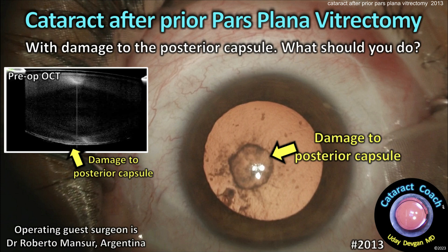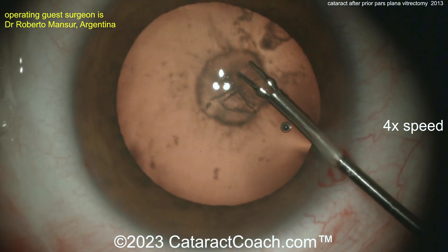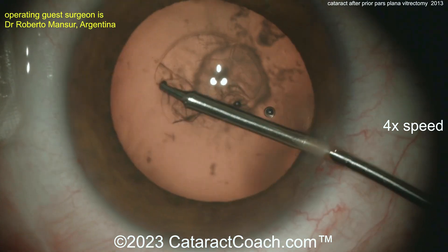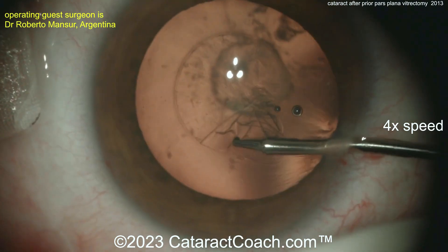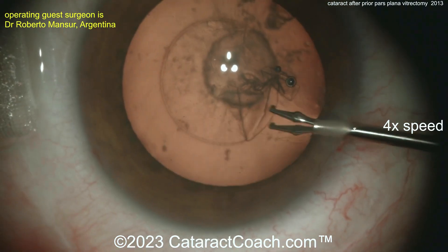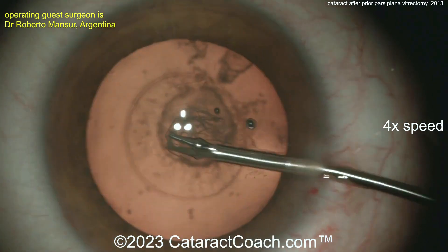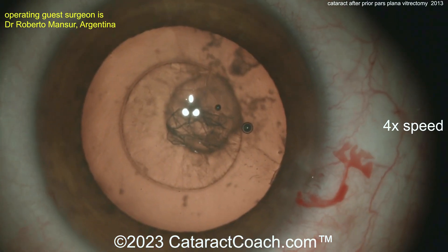Cataractcoach.com — cataract after prior pars plana vitrectomy. You can see there's some damage to the posterior capsule. There's a big defect there on the posterior capsule in this relatively young patient. That's not a posterior subcapsular cataract, it's not even a posterior polar cataract — it was damaged from the vitrector during the pars plana vitrectomy.